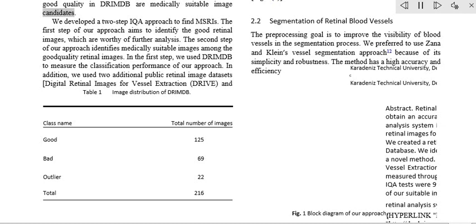The OD can be detected easily in a retinal image because of its unique features such as high intensity value and circularity. However, retinal images might contain such abnormalities that could be extremely similar to the OD. A simple threshold segmentation method might produce inaccurate results in this case. In our method, we use the vertical edge information to detect the OD because the OD is the vertical junction of vessels in a regular retinal image, Fig 3a. Therefore, it is expected that there should be several vertical edges around the OD.